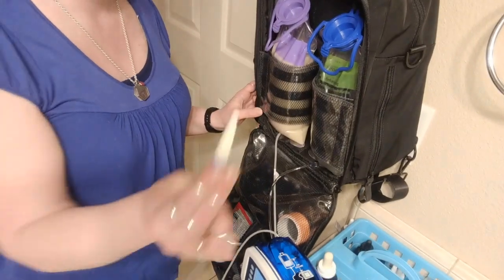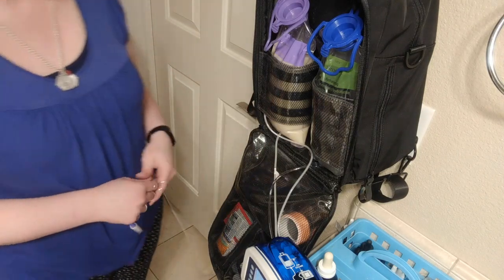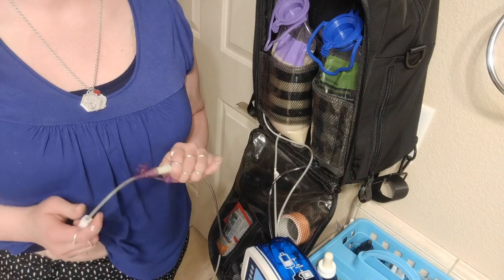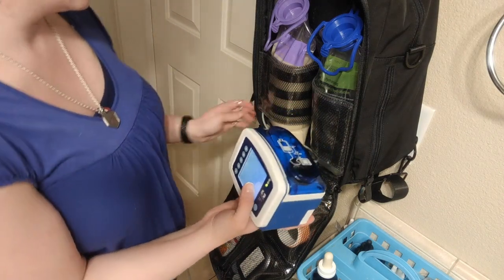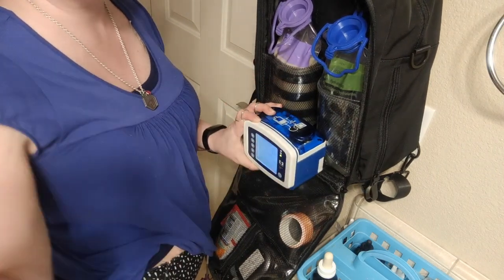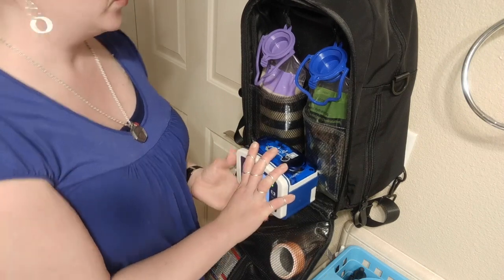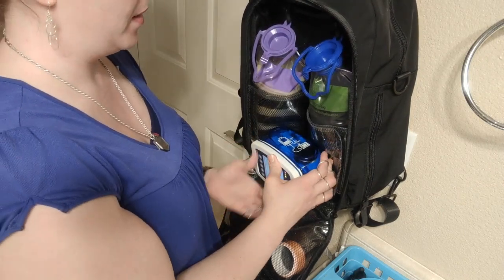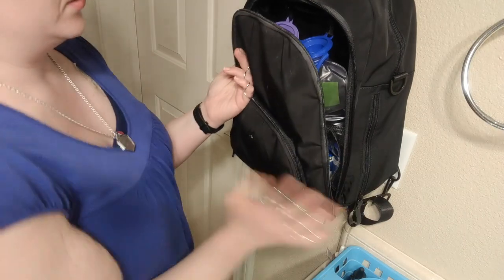And I thread this back through that same slot inside of my bag. Then I take my tube, connect it, unclamp, and then I hit run. So now this is going. I'm going to pull the tubing the rest of the way through. With these bags being so full, it doesn't quite easily fit in at this point. So what I do is I take the bags and I pull them up a little bit. And then that makes some room for me to tuck it in. So that's going, and I just close her up.